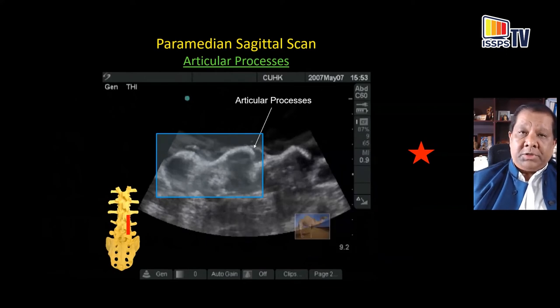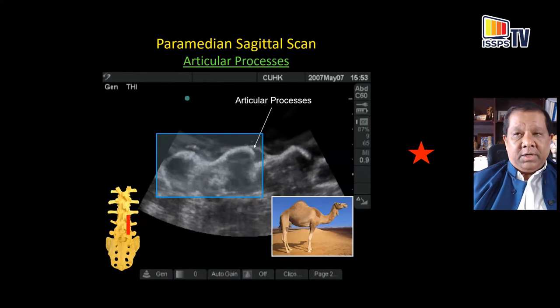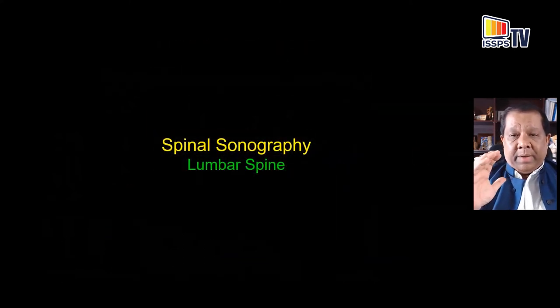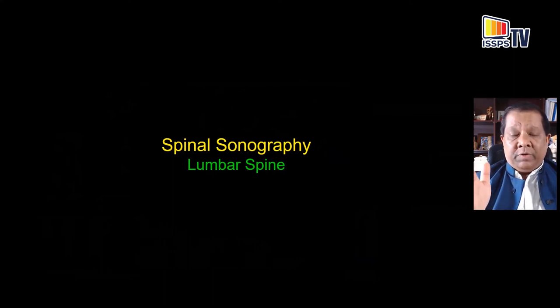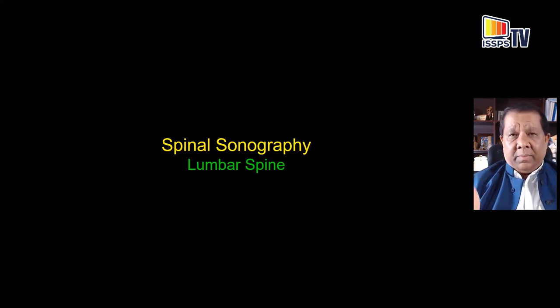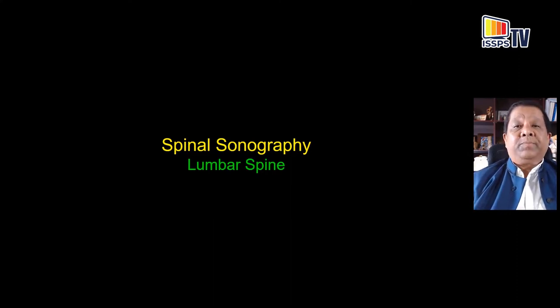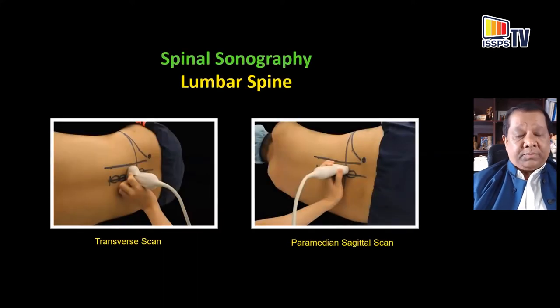If you keep these sonographic patterns in mind and perform a scan before looking at the neuraxial structures, I urge you to first identify which osseous elements you are visualizing — this tells you where your ultrasound plane is located. The ultrasound plane is only about a millimeter in thickness, so if your beam is one millimeter to the right or left, it may be insonating a different structure. Now let's put this together in vivo in a patient or volunteer. We're doing a transverse scan and a paramedian sagittal scan — paramedian because it is to the right of the midline.